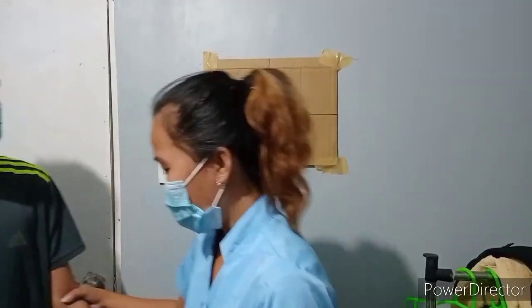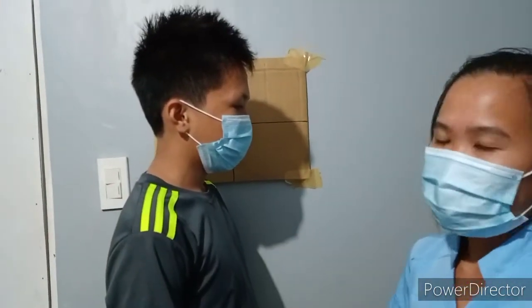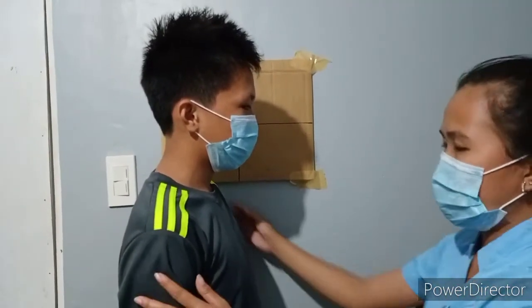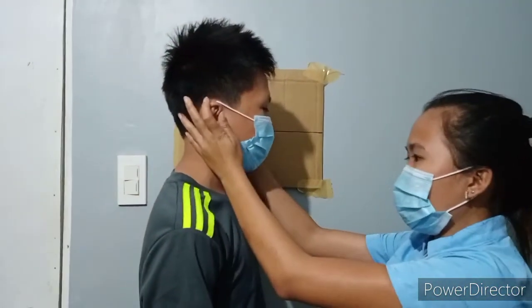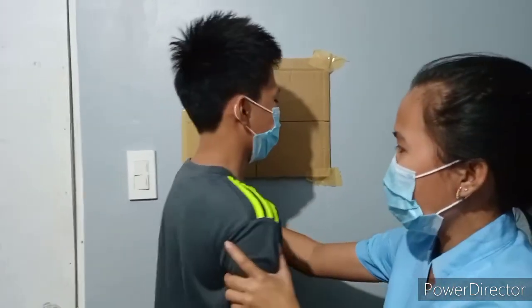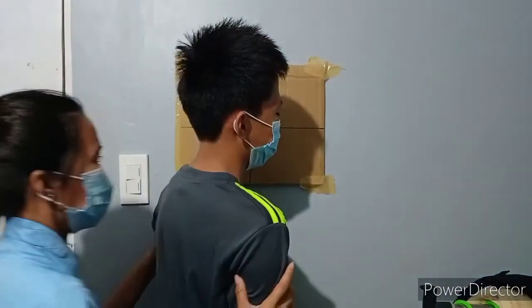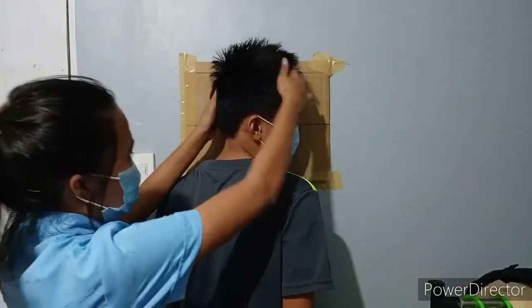Place the patient in an erect position and then place the lateral aspect of the head against the IR. It's either the right side of the patient or the left side of the patient, just like this. The side of interest should be closest to the IR, which is the left side of the patient. And then adjust the head of the patient in a true lateral position and then move the body of the patient in an oblique direction for the patient to be comfortable, just like this.